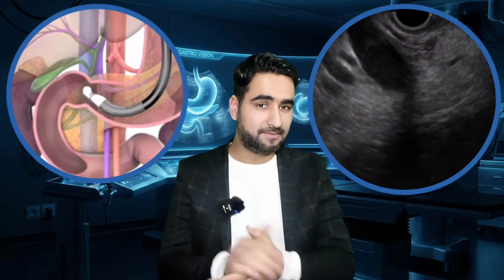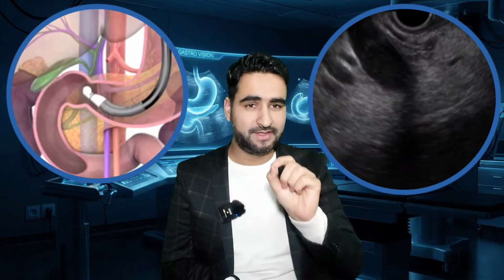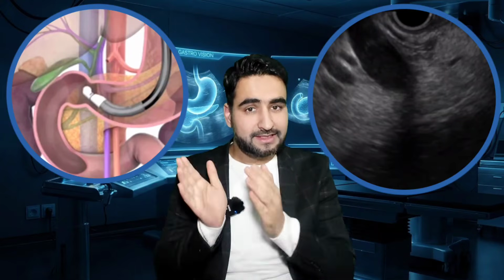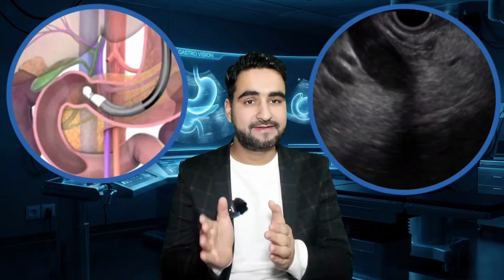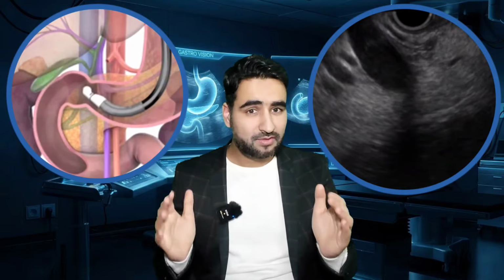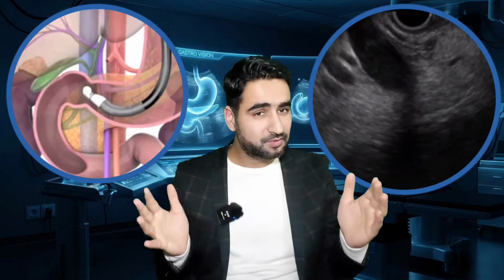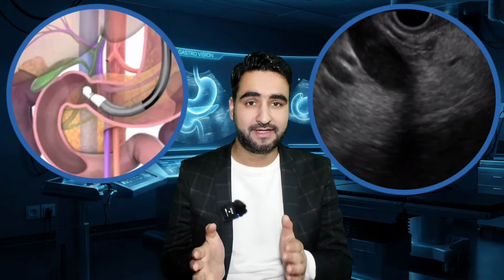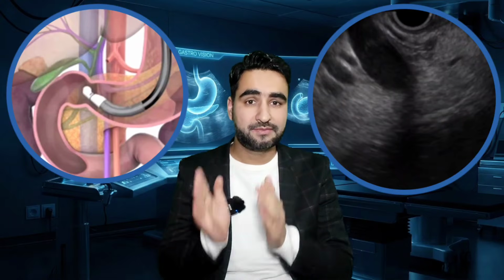This is your landmark, your anchor point, your reference for everything else. Why the portal vein? Because it is large, reliable, easily identified, and centrally located. It is a perfect landmark. Now, let's understand why the portal vein appears on the left side of the screen. Consider the probe orientation. Remember, your transducer position is upside down and slanted.